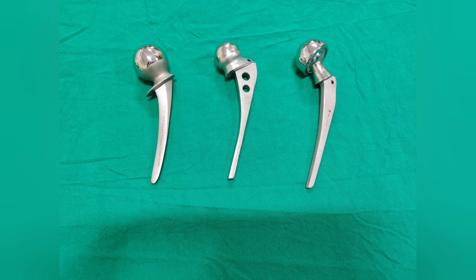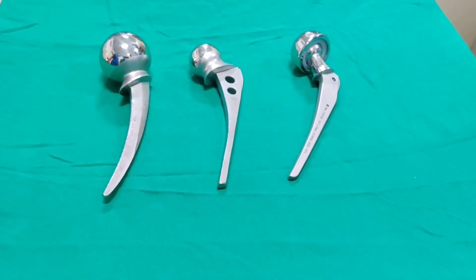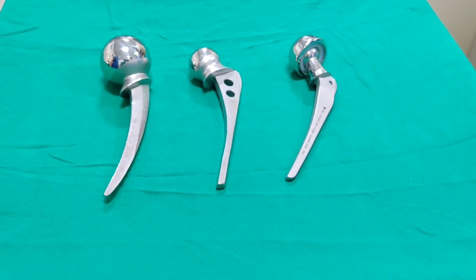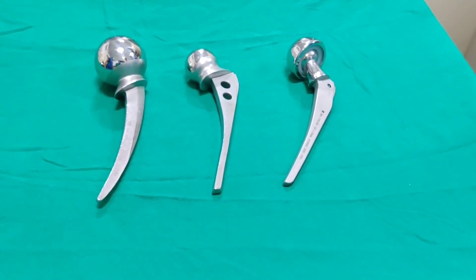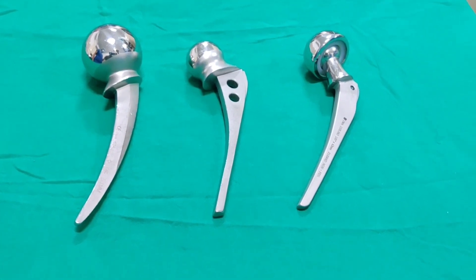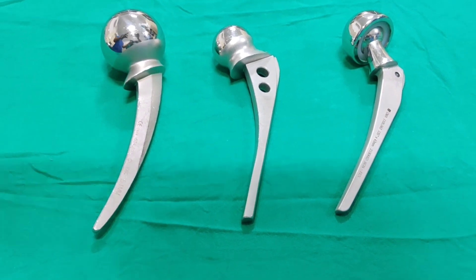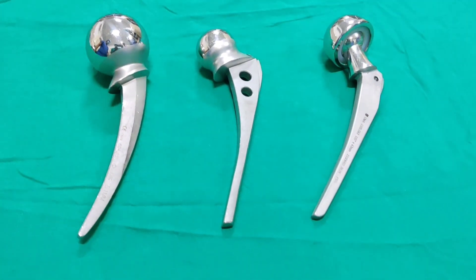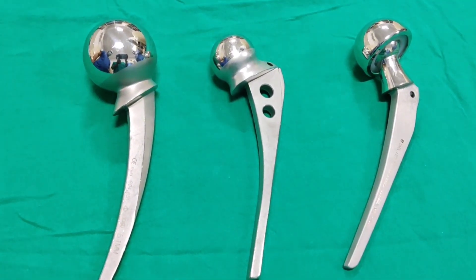Today, I will discuss prostheses for hip replacement surgeries. Hip replacement surgeries are classified into hemi replacement surgery and total hip replacement surgery. Hemi replacement surgery means replacing only the femoral component. Total hip replacement surgery means replacing the femoral as well as the acetabular component. Today, I am dealing with the femoral components for hemi replacement arthroplasty of the hip joint.